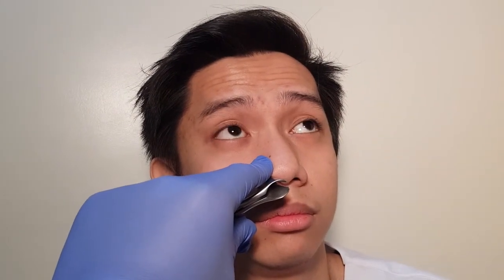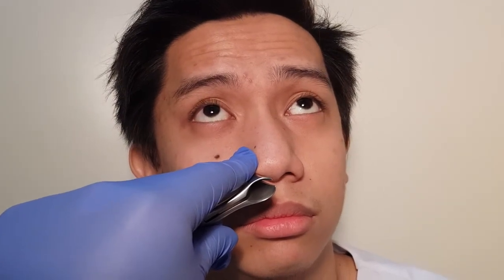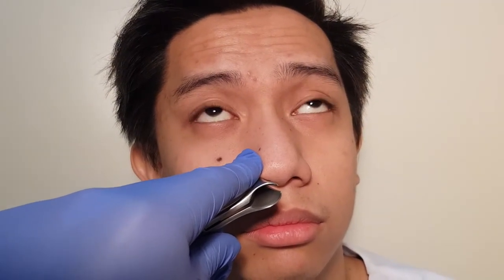When we're done examining the nasal cavity, it is important not to close the speculum inside the nose, as the nasal hairs can be grasped between the mouth of the speculum, which can cause pain to the patient. When removing the speculum, pull slightly, not all the way, and then remove it. We will now look at the patient's other side, and the procedure is repeated.